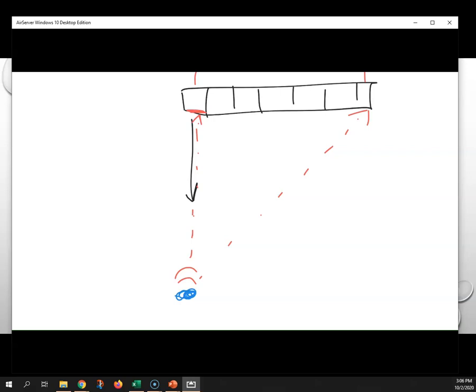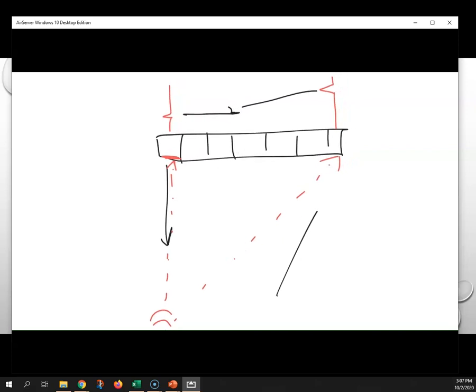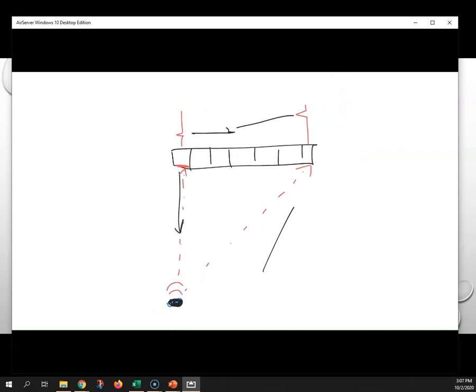And all dynamic receive focusing is, it's taking these two signals that arrive at different times and saying, oh hey, because I'm smart, I know that this is the machine talking, not me. I know that this echo came from that point right there. I can use both of these signals together, combine them to get a clearer picture. And that's what we're going to call dynamic receive focusing. Or D receive F, DERF. And DERF is magic. That's all you really need to know.